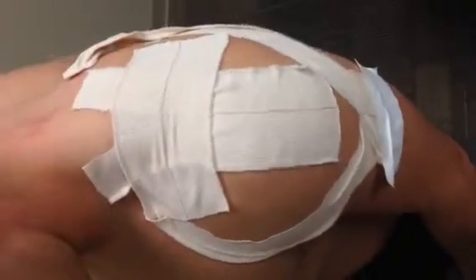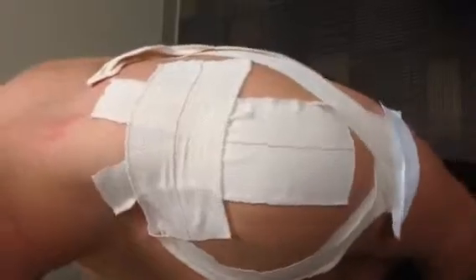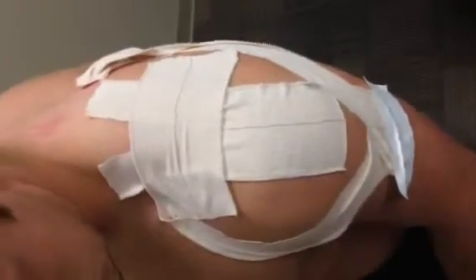If a patient comes in with pain with arm elevation, either in the flexion or abduction plane, this is a kinesiotaping technique that we can do to help facilitate proper orthokinematics or painless range of motion.